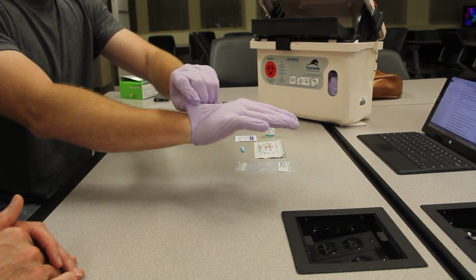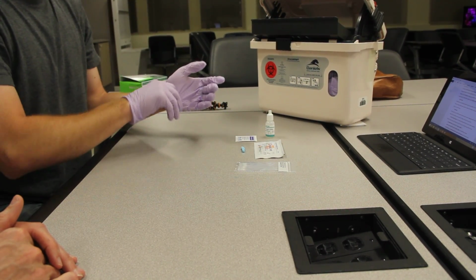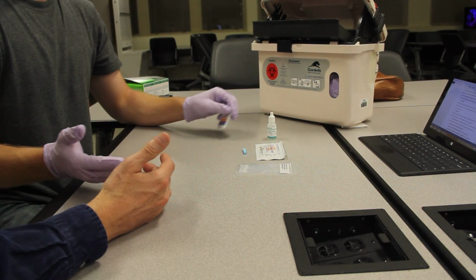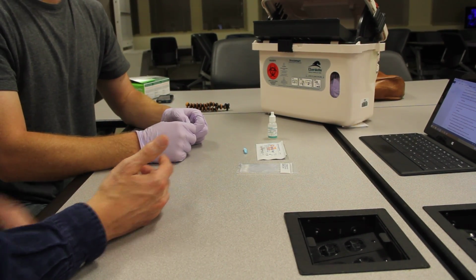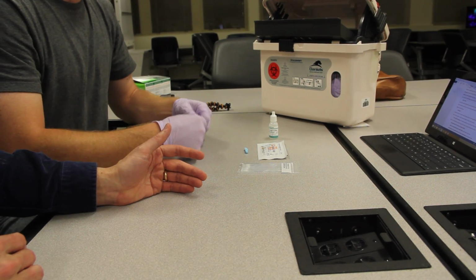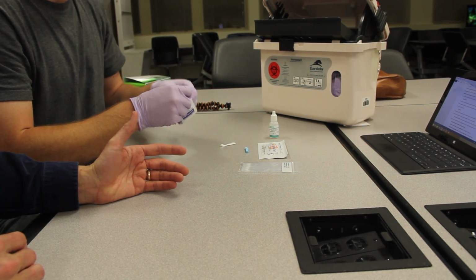Okay. After we've got our gloves on, the next step is to use an alcohol swab on the finger that you'll be drawing blood from. So I believe you are right or left-handed? Right-handed. Okay, so we'll take blood from your non-dominant hand, that's your left hand, and really any finger works as long as it's not the thumb.